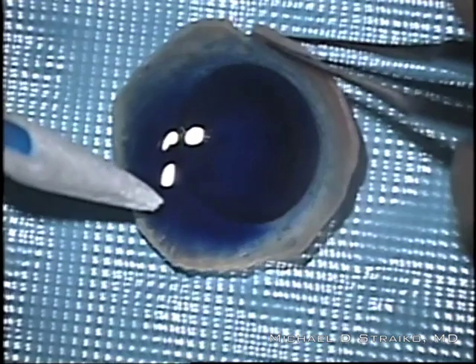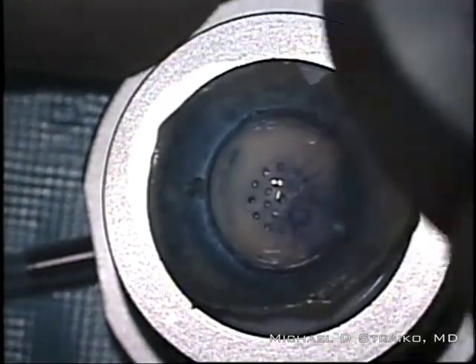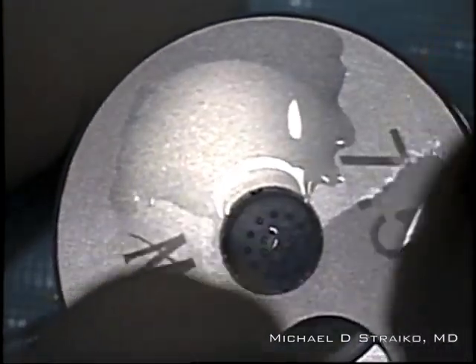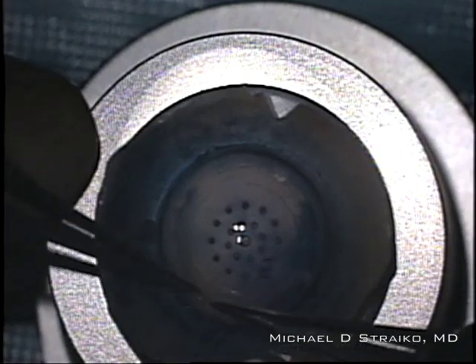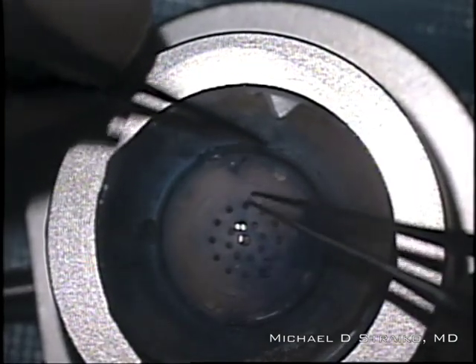Now I'm going to turn my attention to the donor table. I'm using pre-stripped tissue from Lion's Vision Gift, and you'll see that it's marked with an S stamp. I like to stain it first — just a quick 10-second stain with some Tri-Pan Blue so I can see the edges of the graft and check for any areas of damage. These are generally very well-prepared grafts. I put it on a Moria punch — I prefer Moria punches because I find they're sharper than other brands. I tap gently on all quadrants of the punch to get a partial thickness trepanation, and once I have that partial thickness punch, I break the Descemet membrane and peel it.